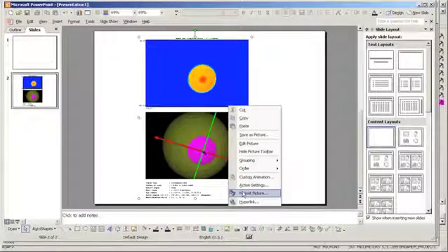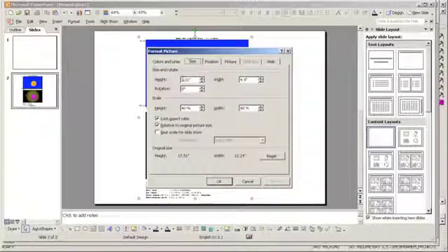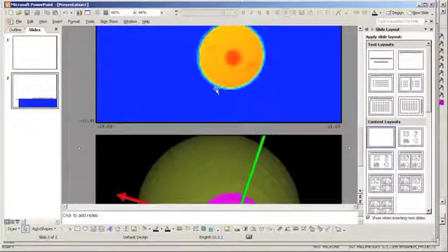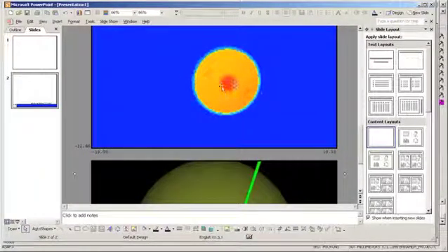And if I make that larger again, let's go back to 100. Let's look at that a little bit. We can see the reflection of the center of the IOL on the front of the cornea. We can also see some reflection of the haptics that were surrounding that intraocular lens. So this is an application of AHEM to investigate reflections off an intraocular lens when the iris has been removed from the eye.